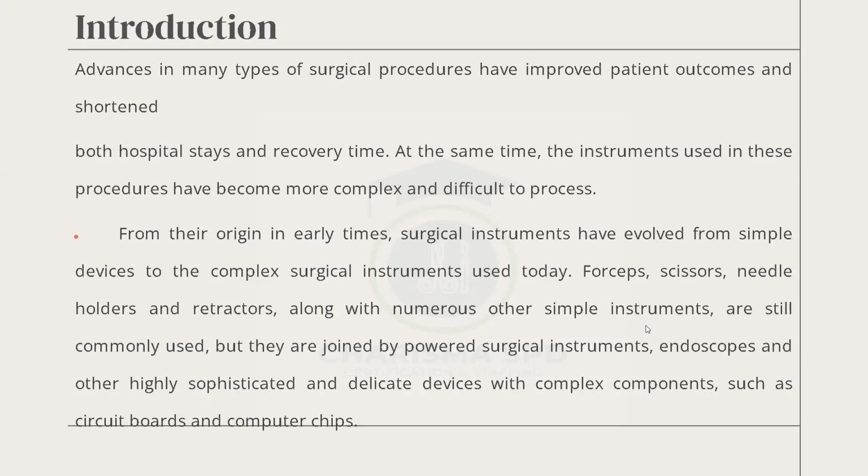So basically what we are talking about here is that with the advancement of medicine, we have moved from simple instruments to complex ones that use electrical power, and some also use scopes or lenses. So those are the complex ones that we want to look at today. Unlike the scissors and the needle holders, which are basic ones, these ones are a little bit complex. Next slide, Director.